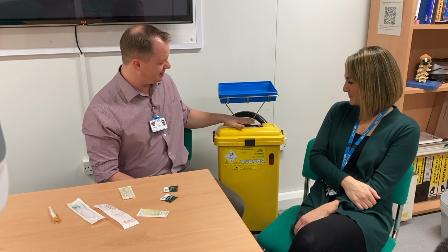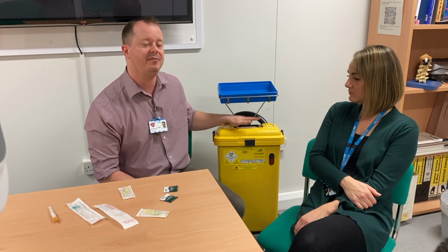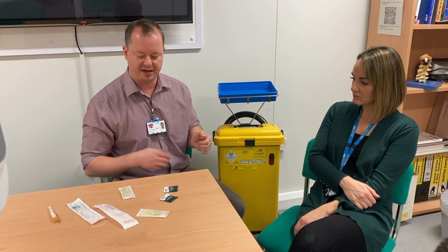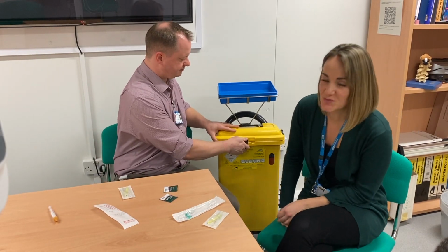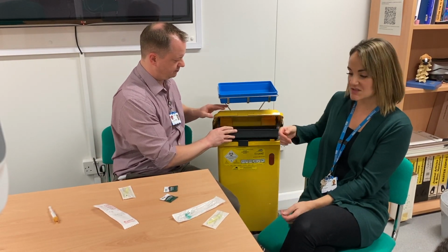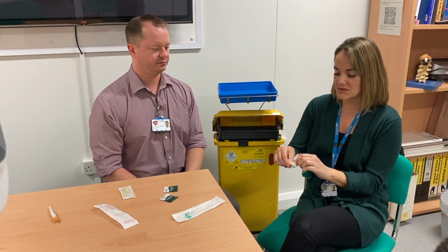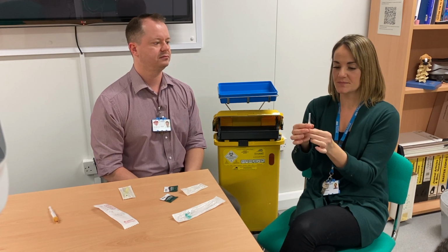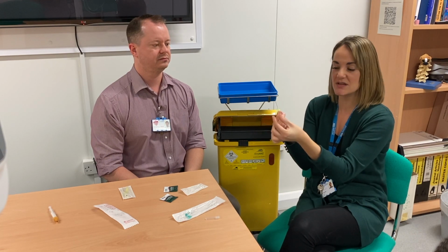Okay, that's your Sharp Smart device, so that's your sharp bin, and it should be with you every time you perform any skill that involves a sharp. There are some other things, I'll let Teeny tell you about those. Yeah, so Tom's talked about sharp safety and all the things we have, like the sharp bin, but all of our needles in the trust actually have a safety device on them. So I'm just going to take this lid off here. As you can see, this coming out here is like a little sheath.